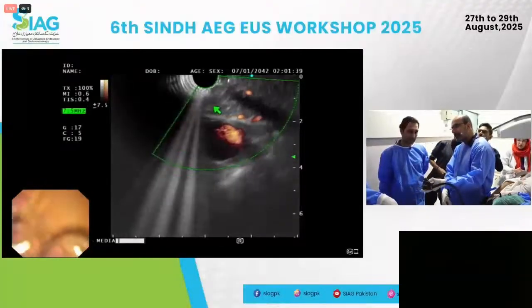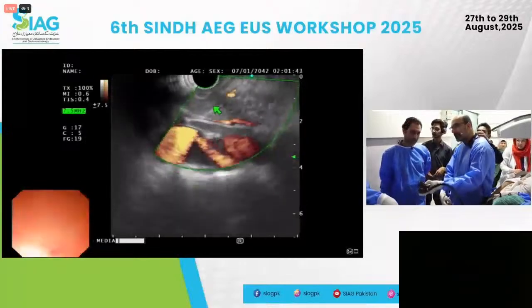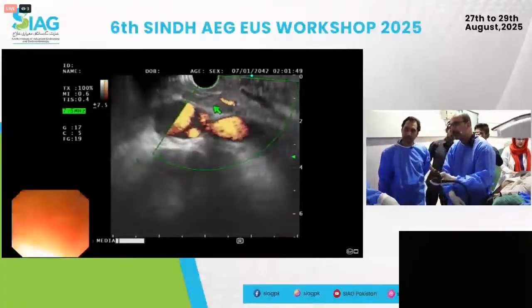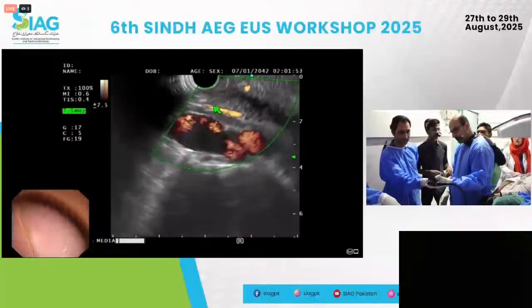And keep the big wheel not too tight, okay? And just gently clockwise, counterclockwise, looking for your two depths. Okay? And be ready to push in if it's like the unstable scope position. So I'm going to hand it to you here. Big wheel towards you.